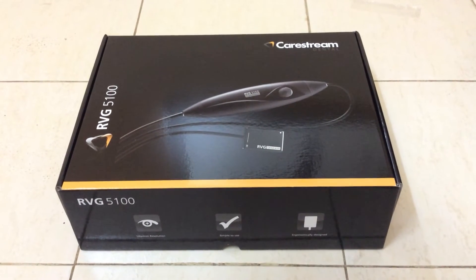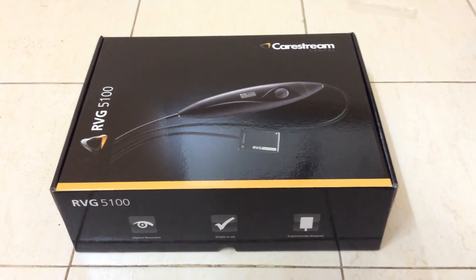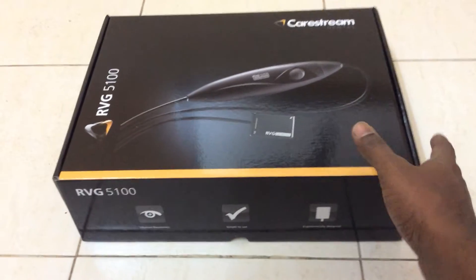Hi everyone. Today I am unboxing the CareStream Dental RVG 5100. Let's see what is inside the box.